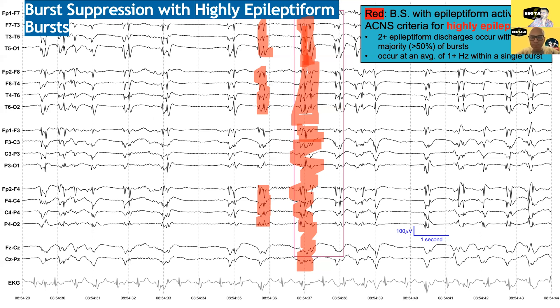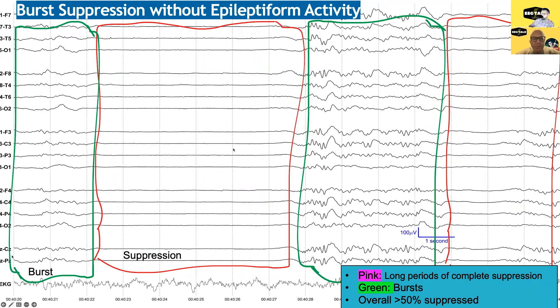If the bursts contain any potentially ictal pattern within them, you can also call them highly epileptiform. This next example is just regular burst suppression without epileptiform activity — this is what it looks like if you give too much propofol, or high doses of midazolam or other drugs.